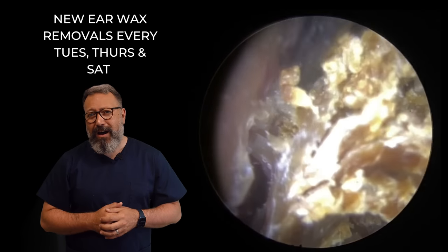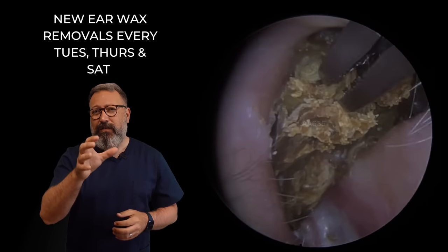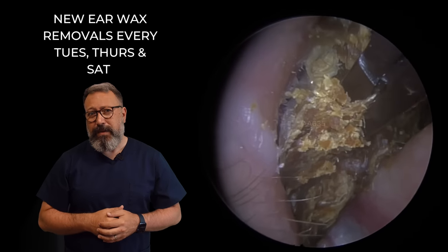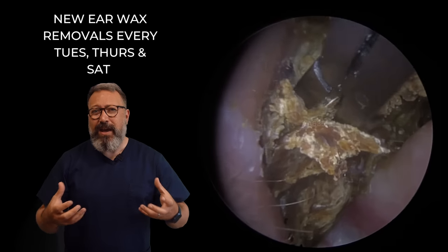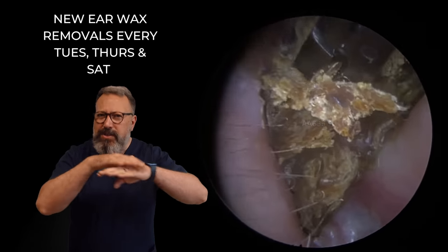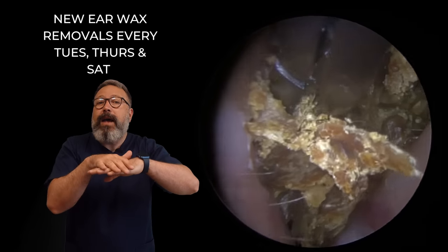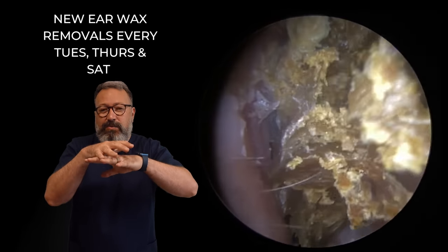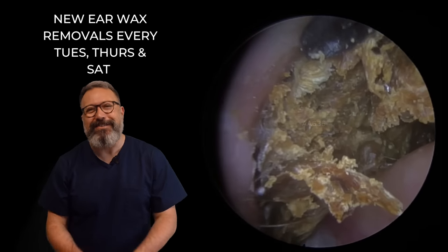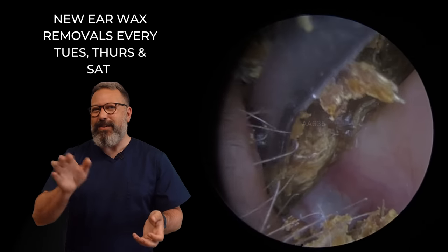Look how hard that is — it is just rock solid, but it's also very crumbly. Watch what happens when we get a grip here. See how it just breaks away? I want you to imagine this as lots of layers of dry wax and skin, one over the top of the other — sort of quite striated in there. What will happen is when you start to get a grip, those layers will just peel apart, like a kind of flaky pastry, but much less appealing.